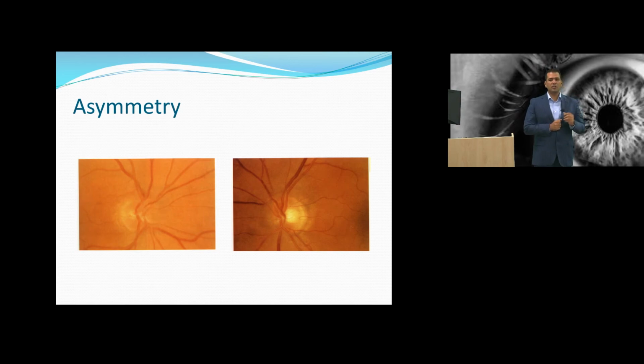Now, if you were using a 60 diopter or 66 diopter lens to view the fundus, the magnification is 1x. So whatever size you are measuring on the slit lamp is the size of the nerve. Now, if you're using a 78 diopter lens, the measurements need to be multiplied by 1.2. So whatever value you get times 1.2, and that's the size of the optic nerve head. If you are using a 90 diopter lens to measure the size of the optic nerve, then you need to multiply the value by 1.3, and these are the correction factors for magnification.